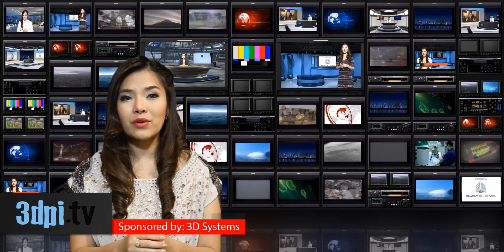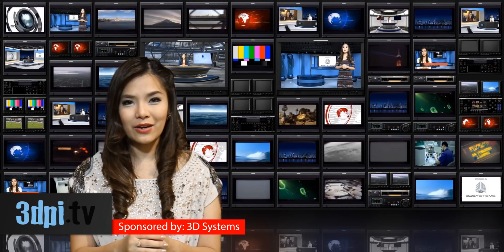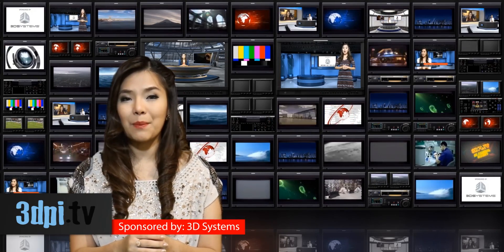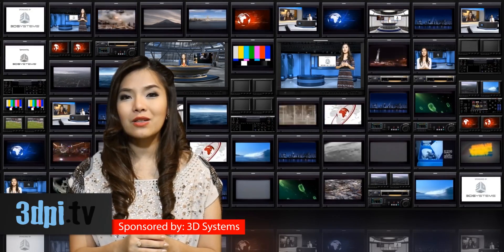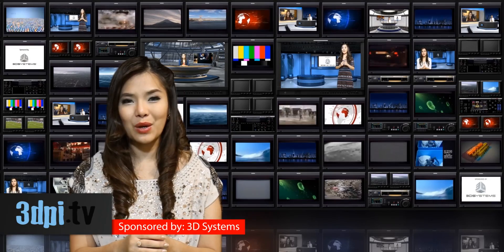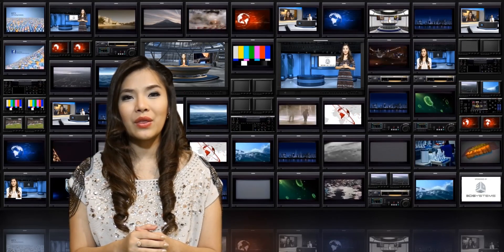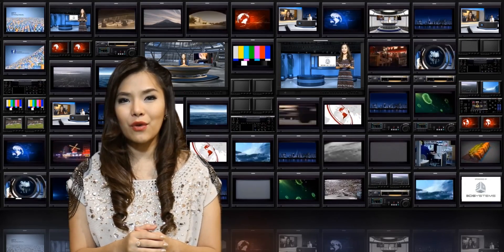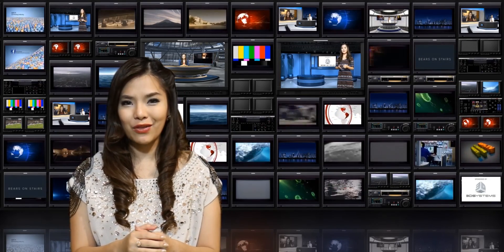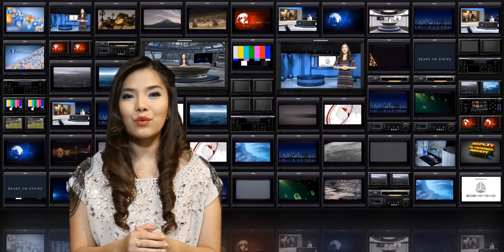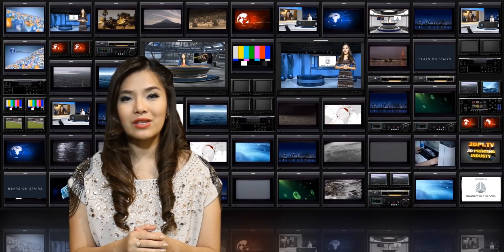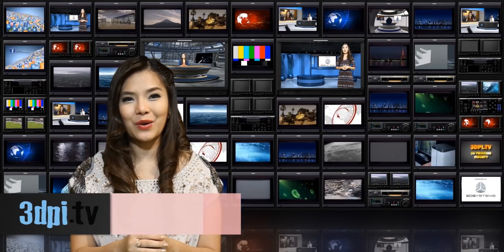The VisiJet Pearlstone Dental Material is available in matte, plaster, or glossy print mode. The material can print within a 30 micron layer thickness and with an average accuracy of 50 microns.